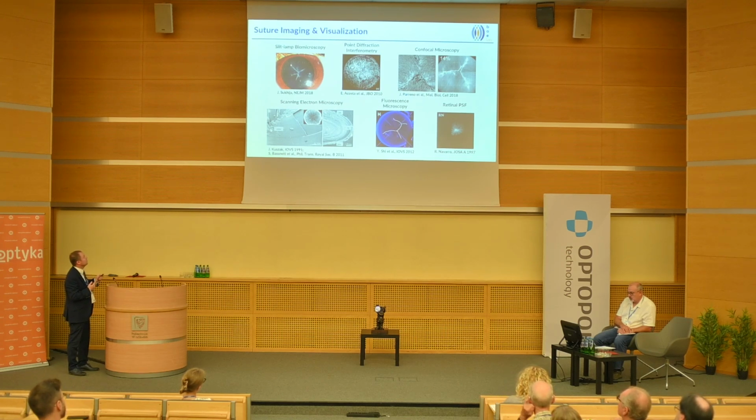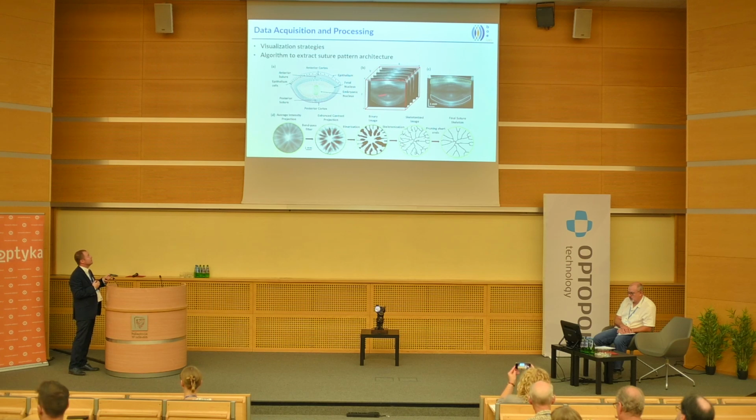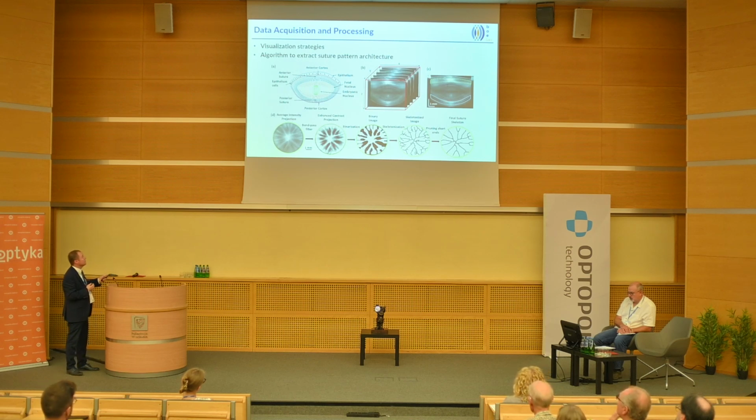Maybe if you have sutural cataract, then you can observe them clinically in vivo, but there are some rather microscopic methods, studies or indirect methods that allow to visualize the impact of sutures on the quality of the eye. However, in our case, we perform specific analysis of our data. So we use these slabs from the cortex, and this enabled us to generate the projection images. And you can see that there are some bright branches, and these are actually sutures. And we did some kind of processing in order to get the information about the structure of those sutures.